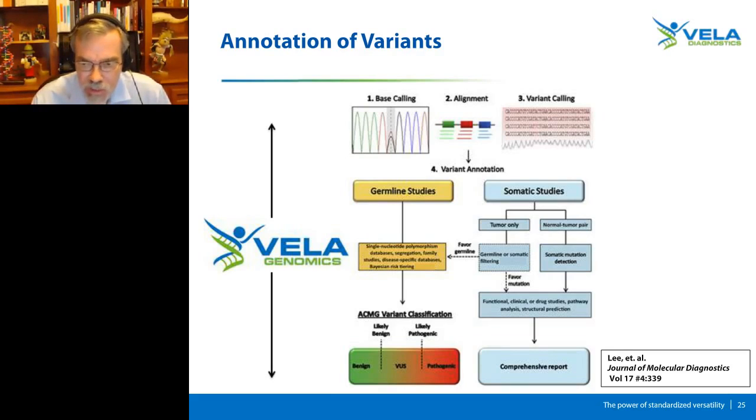The problem is that sequencing the germline is a quality check and not always reimbursed. So you'll have twice the cost, and the value of doing this control is still being debated. If this were a tumor-only bioinformatics pipeline, then we would filter the variant list against a list of normal or naturally occurring variants in the non-pathogenic population. This is the germline filtering to remove the non-pathogenic variants, and in this way we'll get a better list of pathogenic variants to curate.